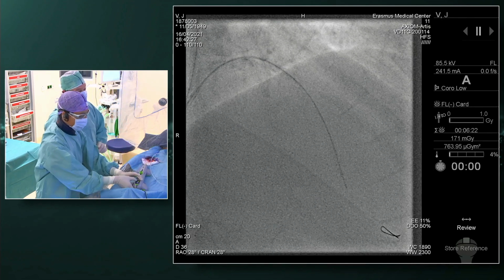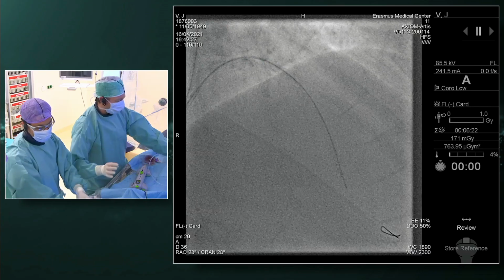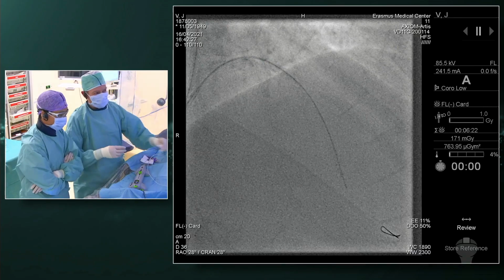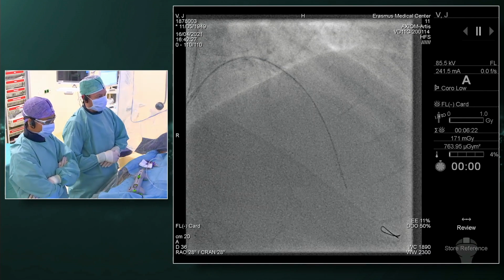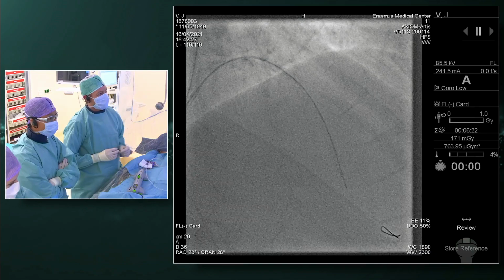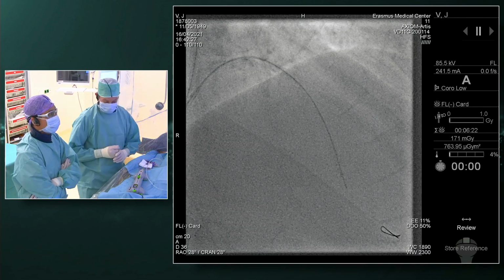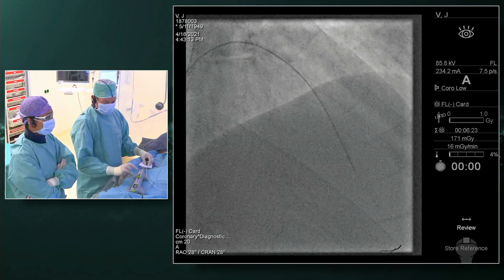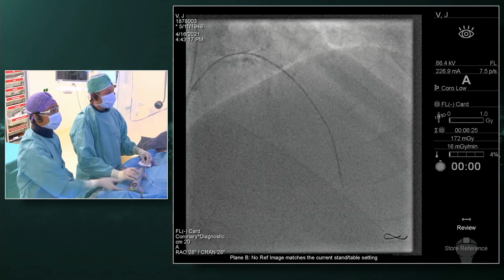What I like about this device is the fact that it's very controlled. The Viper wire lets itself maneuver quite well. And with the glide assist on, at only 5,000 RPM, you can very easily engage somewhat more distal in the artery, where you can start the orbital sanding. So let's do that. Wings out. Let's press the low speed RPM button and we gently start.